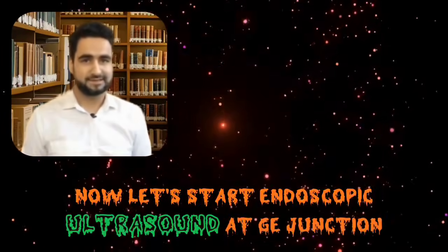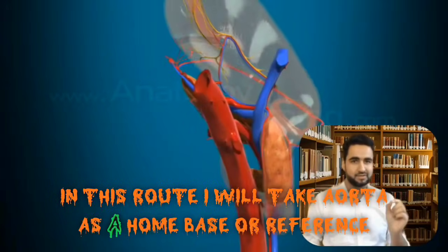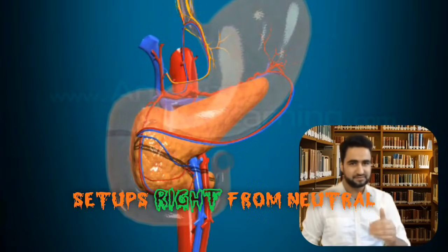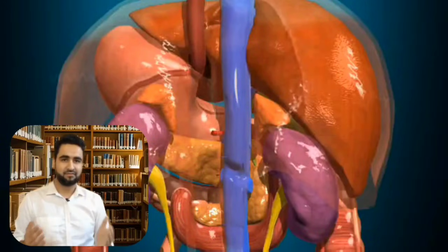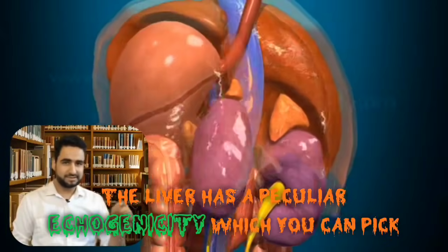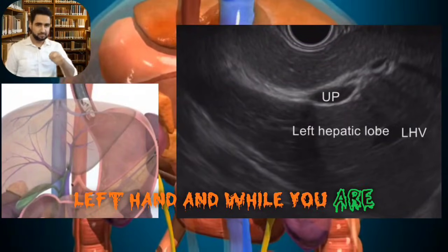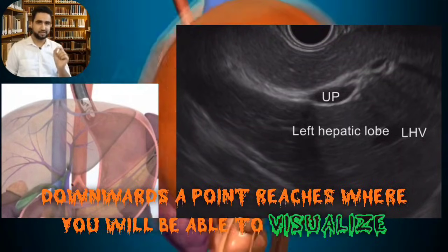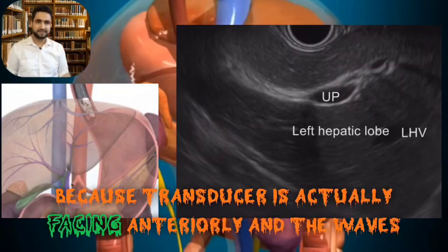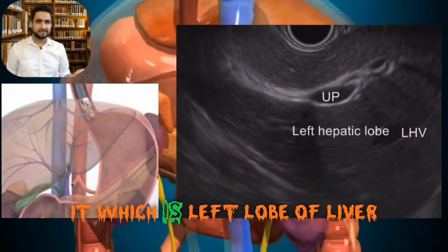Now let's start endoscopic ultrasound at the GE junction station. In this route I will take the aorta as a home base or reference structure. I will divide this approach into steps starting from the neutral position. The first step is identifying the left lobe of liver and the left hepatic vein. The liver has a peculiar echogenicity which you can pick up easily. While your scope is in the neutral position and you push it downward, you will visualize liver echogenicity — this is the left lobe of liver, as the transducer is facing anteriorly.